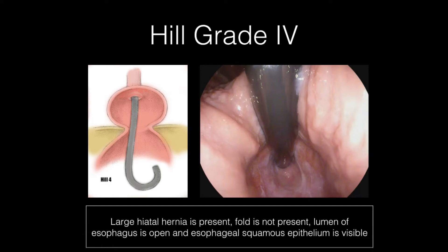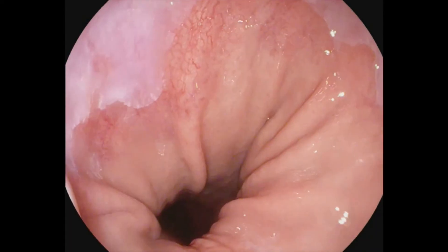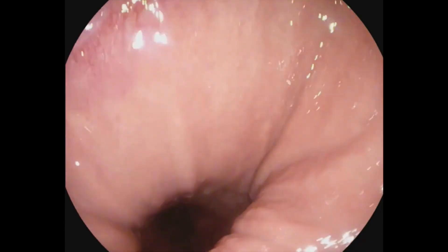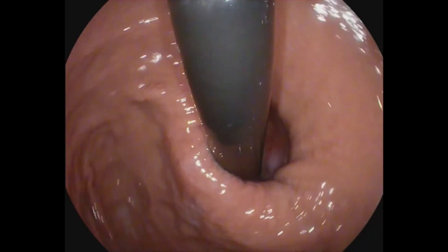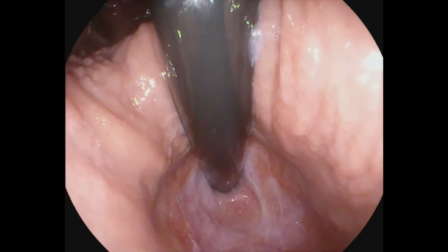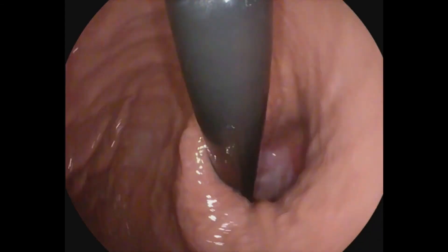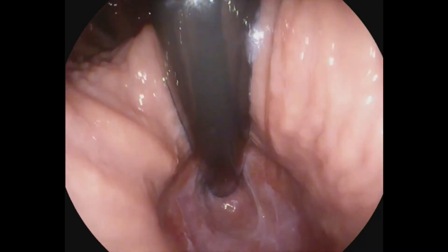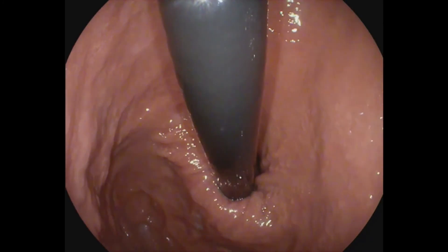Finally, with a grade 4 valve, the patient has a large hiatal hernia and essentially no fold, so that the lumen of the esophagus is gaping open, allowing the squamous epithelium to be viewed from below. In a Hill-grade 4, the hiatus is completely open and the scope is never gripped by the valve. The valve is so enlarged that you can fully see the Z-line as well as the esophageal squamous mucosa. There is obvious stomach in the chest.